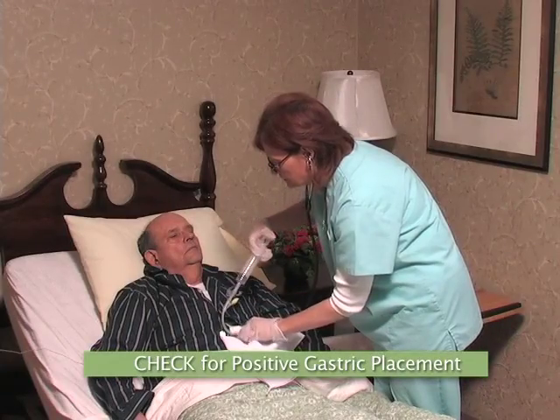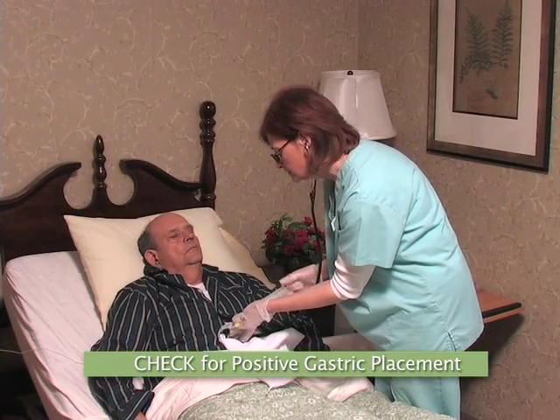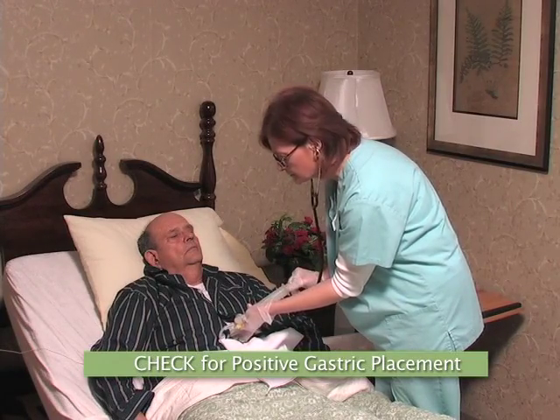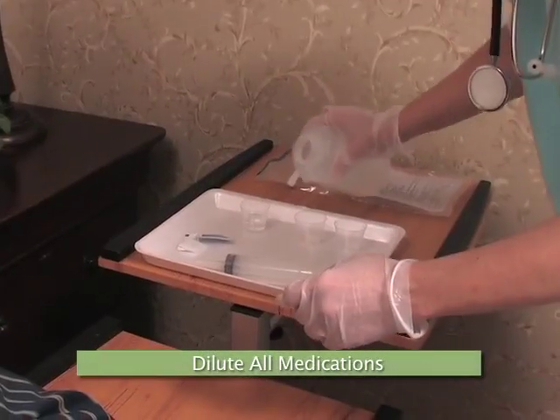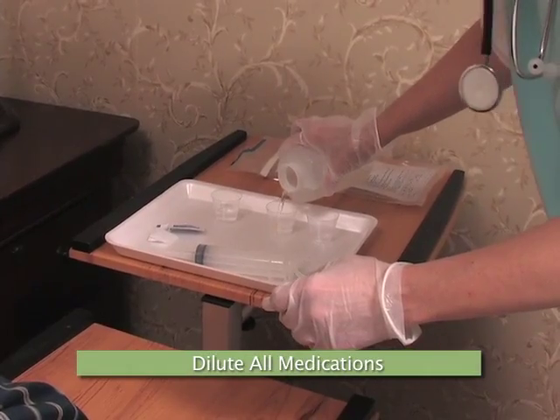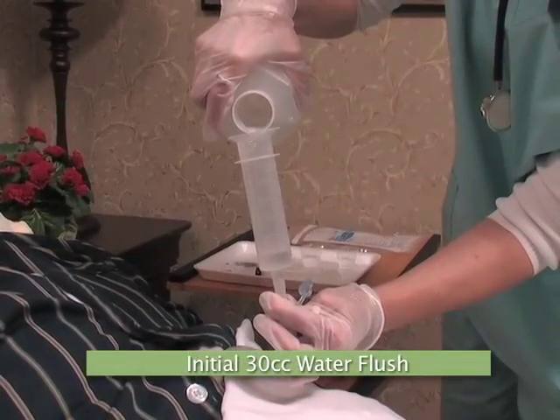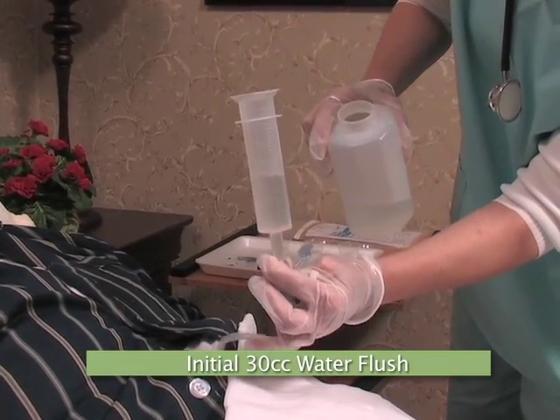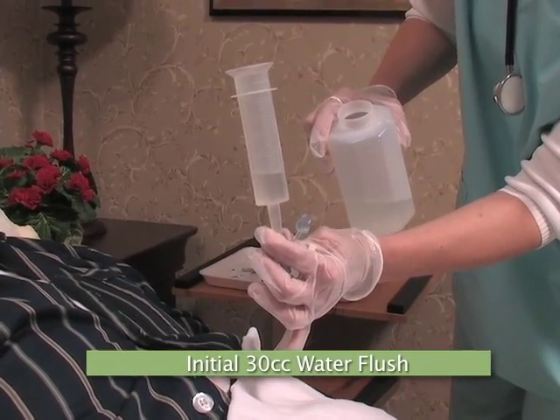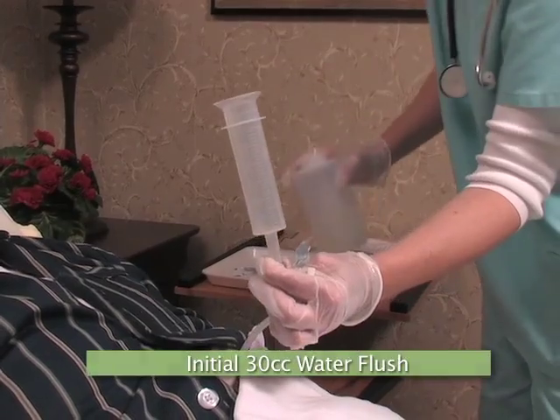The nurse checks for positive gastric placement according to her facility policy, usually by auscultation to verify a gurgle sound, followed by a residual check. Each medication is diluted and dissolved by using the pre-measured water. The nurse starts the procedure with a 30 cc warm water flush, then follows with a medication while pinching the tube between each flush and medication to prevent excess air.